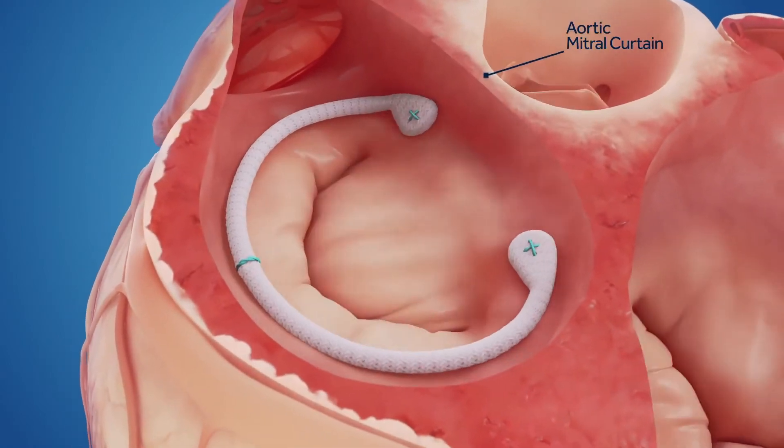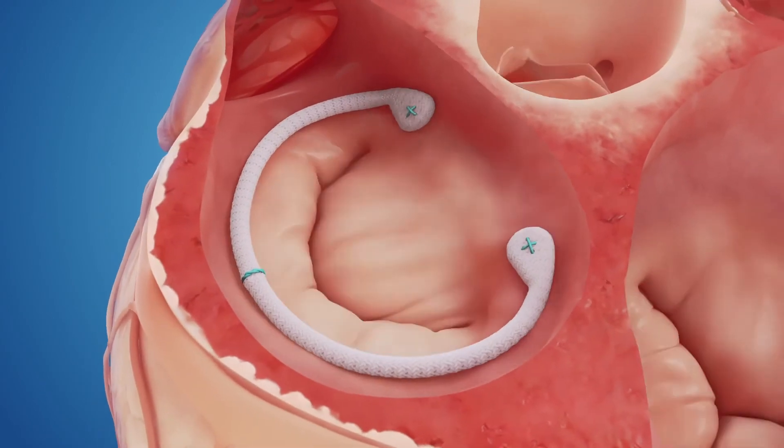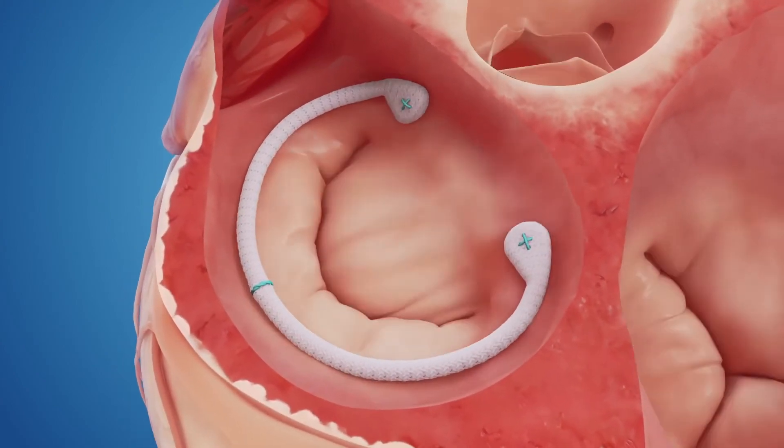Now let's see the repaired valve with the CG Future Band. The band anchors nicely into the trigones, securing the repair. The aortic mitral curtain is free to move naturally throughout the cardiac cycle.